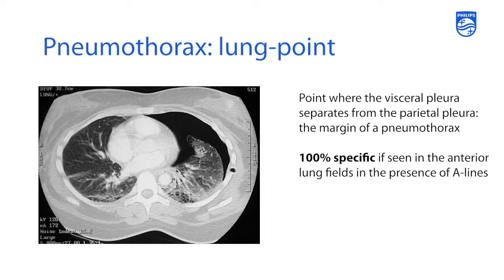Another finding often seen in a patient with a pneumothorax is called a lung point. The lung point is the point where the visceral pleura separates from the parietal pleura — it's the margin of a pneumothorax. As delineated by the black arrow on screen, that's the point where a portion of lung is making contact with the chest wall, and then suddenly the pneumothorax in the anterior portion causes a separation between the visceral and parietal pleura. This finding, if seen in the anterior lung field in the presence of A-lines, is 100% specific for a pneumothorax.